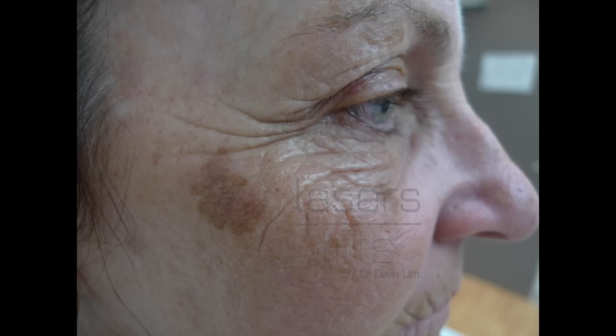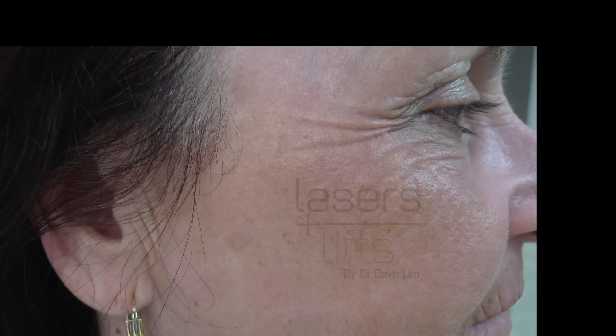This lady has not only seborrheic keratosis but also wrinkling, and I treated her with erbium together with CO2 laser. You can see there's a nice blend — it's slightly pink, but the pinkness will fade and there's also an improvement in wrinkling.